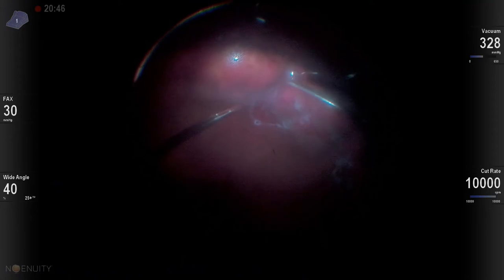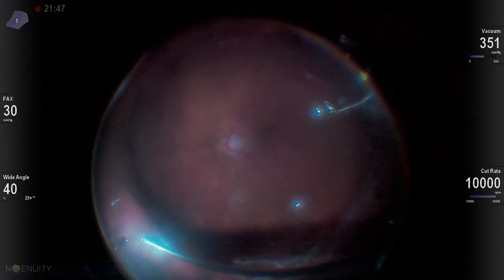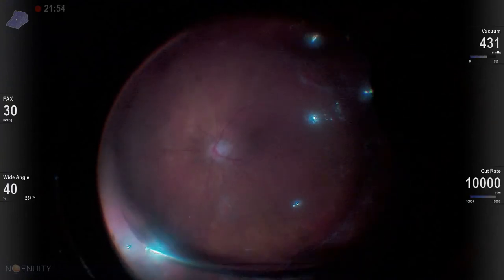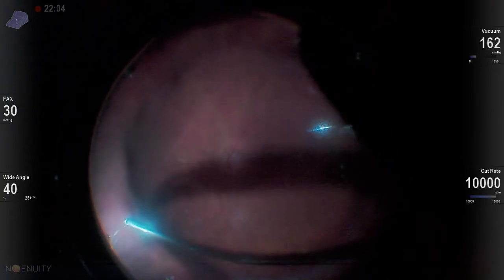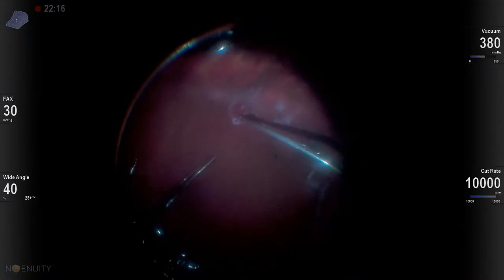We're able to drain through the break really nicely, and then I do vitrectomy under air — I do this whenever I have anomalous vitreous insertion or just a lot of vitreous left inside the eye. I use the shadows of the vitrector as well as the reflection when the vitrector touches the vitreous to know when I'm actually removing it.